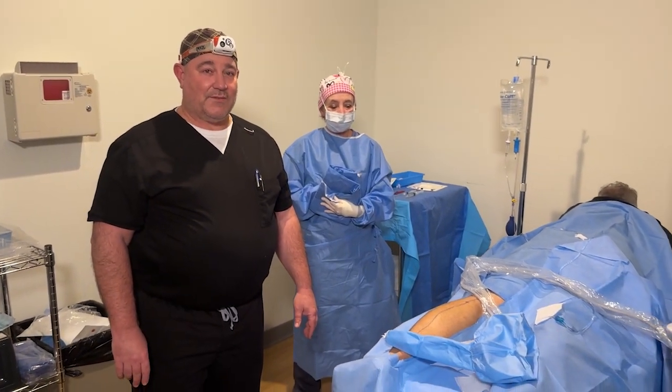I'm Dr. Michael Kahn, vein surgeon and general surgeon, and today we're going to be performing a laser ablation of the left small saphenous vein.